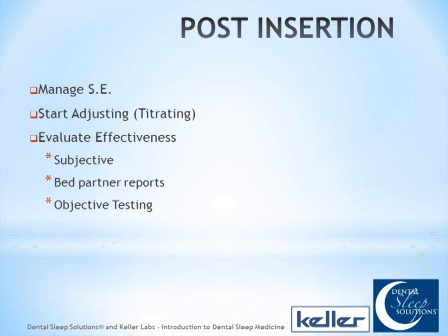And do you recall, Guy, what is a half turn? A half turn's a quarter millimeter. It's a quarter millimeter, correct? Right. So it takes 4 half turns to make a millimeter. And the bands now with the EMA, they're coming out with the bands that are in 1 millimeter increments now. They used to be 1.5 millimeters or so. So that's going to be real easy. They're just going to have the numbers on them, like 15, 16, 17, 18. And we know those are millimeters from the center of the button to the center of the next one.